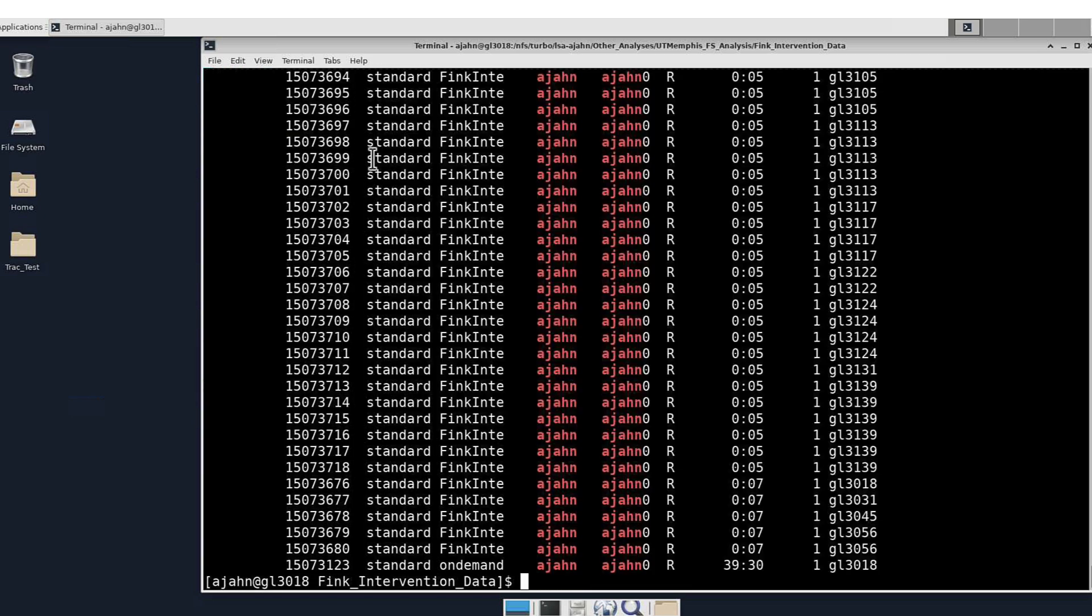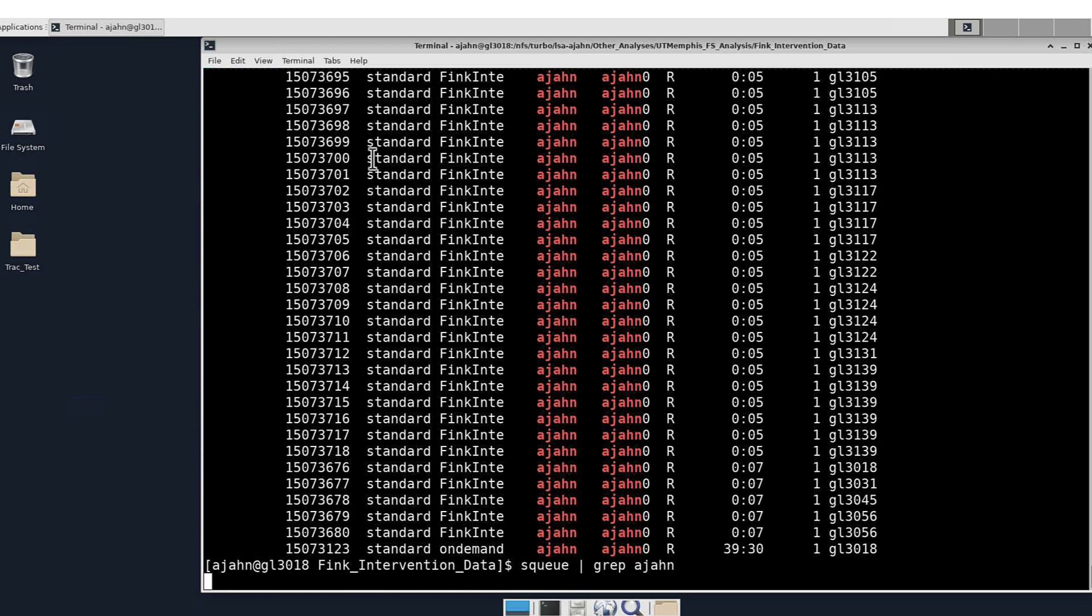At this point, you could then try to replicate the results of the original Fink et al. 2021 paper. Good luck, and I hope this helps you with the segment_subregions command.